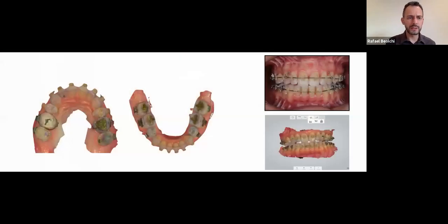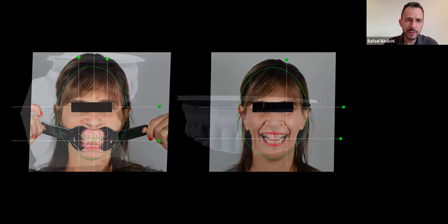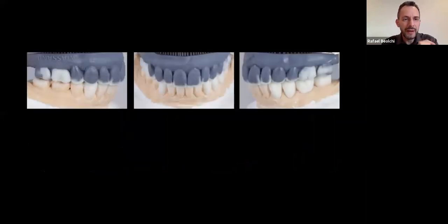Why is that important? Because Marcelo did all the planning, he did everything. And I like that because you don't need to rely exclusively on digital dentistry, but you can also do that. So it is kind of an association of old school with, let's say, new school or more modern technology. And this is the planning with DSD, the static and the functional. A 3D printed model was made as well. And what I like is that you can always refine that.